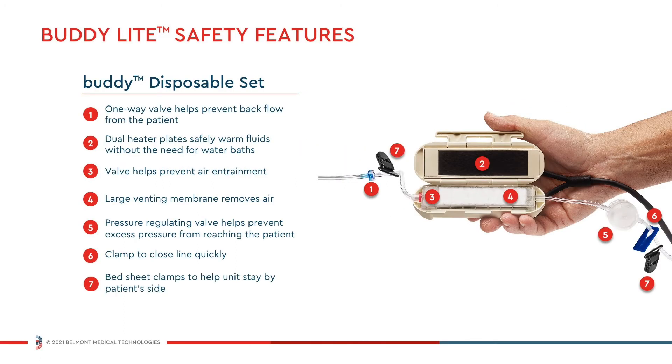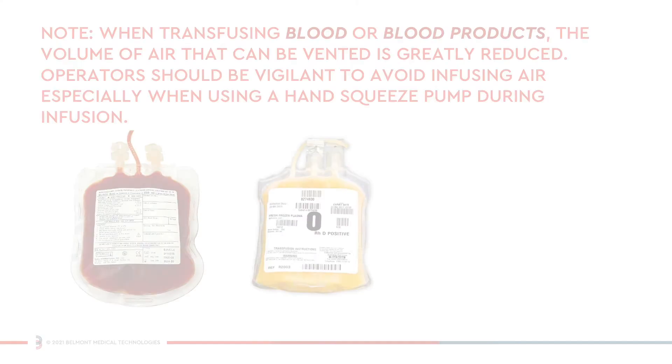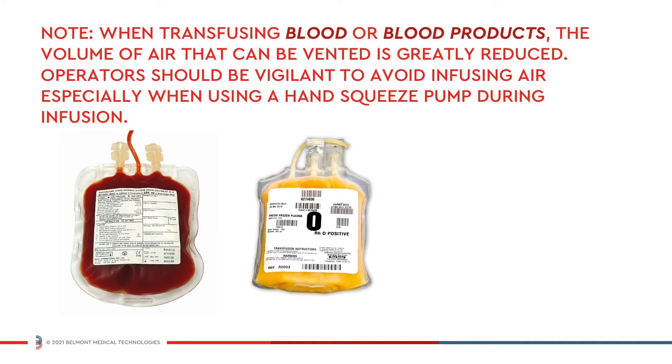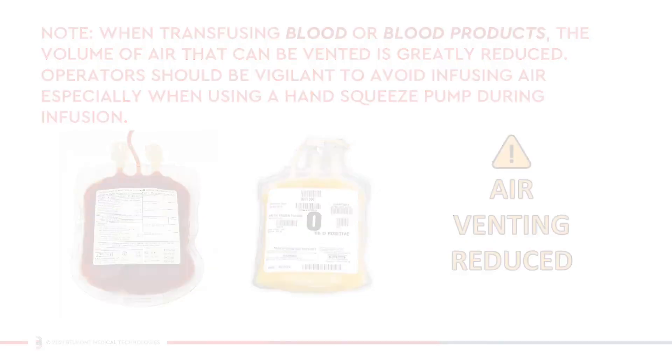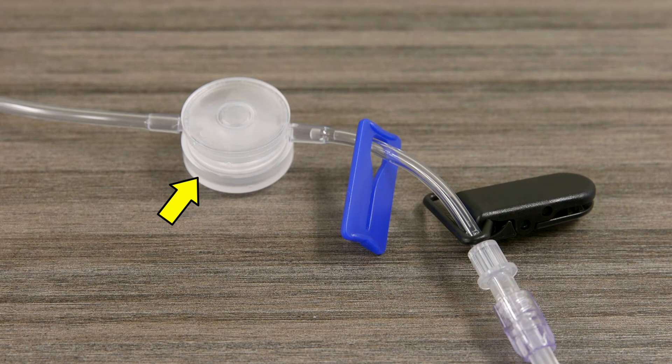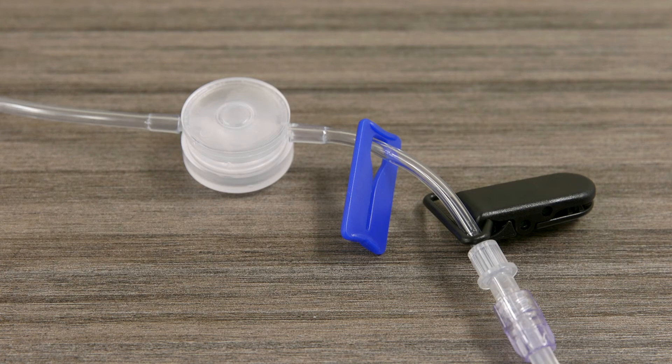The buddy disposable set is equipped with multiple safety features that can help protect the patient from unsafe operating conditions. As crystalloid solution travels through the disposable set, the microporous membrane located within the disposable automatically vents air. When transfusing blood or blood products, the volume of air that can be vented is greatly reduced. Operators should be vigilant to avoid infusing air, especially when using a hand squeeze pump. A pressure regulating valve prevents abnormally high pressure greater than 300 mmHg from reaching the set or the patient. If pressure exceeds 300 mmHg, the flow of fluid will stop, and will continue when pressure is reduced to a safe level.